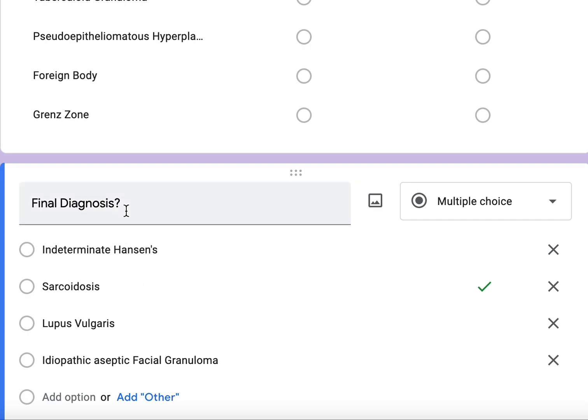So if you look at just the four diagnoses presented here, lupus vulgaris definitely is in the differential clinically. Histologically, there is a lichenoid and granulomatous infiltrate in lupus vulgaris, but it is not sarcoidal. Often you may see caseating necrosis in lupus vulgaris, and there is pseudoepitheliomatous hyperplasia, which is absent in this case. So lupus vulgaris is ruled out on that count, but having said that, atypical presentations are common, and sarcoidosis is really a diagnosis of exclusion. So I would certainly in this case do a Mantoux test and chest x-ray and make sure that the patient does not have any suggestion of cutaneous TB before proceeding to treat the patient as sarcoidosis.